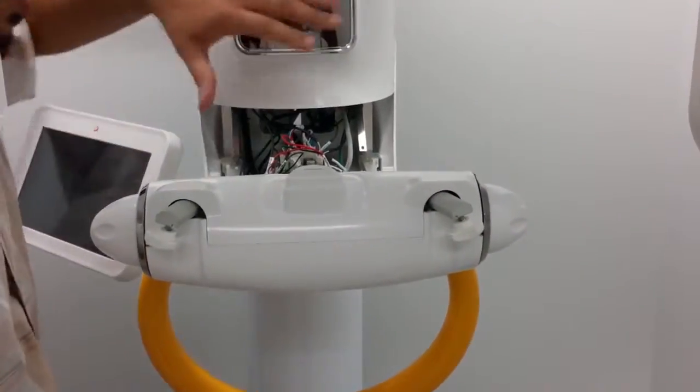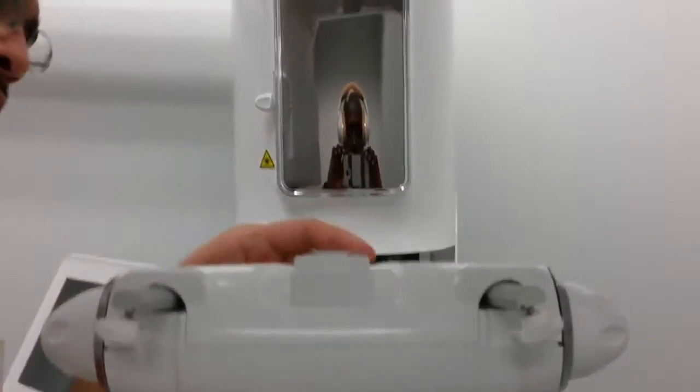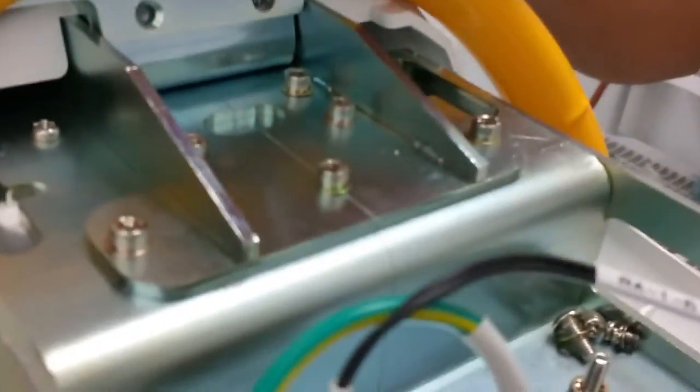After this piece has been removed, we have access to two screws on the front of the o-ring. These can be loosened here and here.